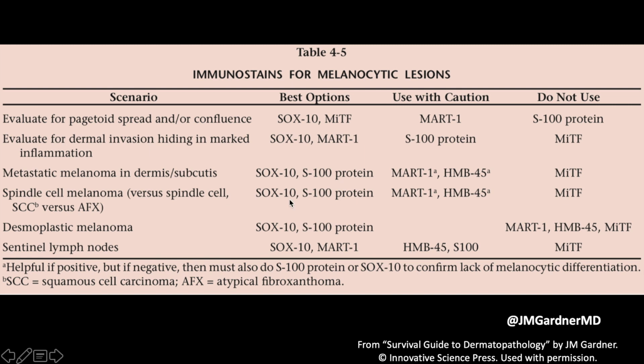And I didn't really address PRAME here. I've only been able to use PRAME in the past year or so. I quite like it. It does work pretty well, but I've definitely seen melanomas that didn't have PRAME, and I've seen nevi that express PRAME. So nothing's perfect, but it is an extra tool to use in ambiguous melanocytic lesions to help us sort them out.